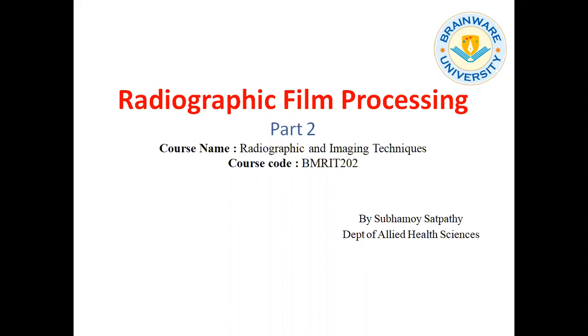In the last class, we discussed radiographic film processing: development, film development. That is basically the conversion of latent image into visible image by the silver ions, which are converted to metallic silver to produce the visible image.